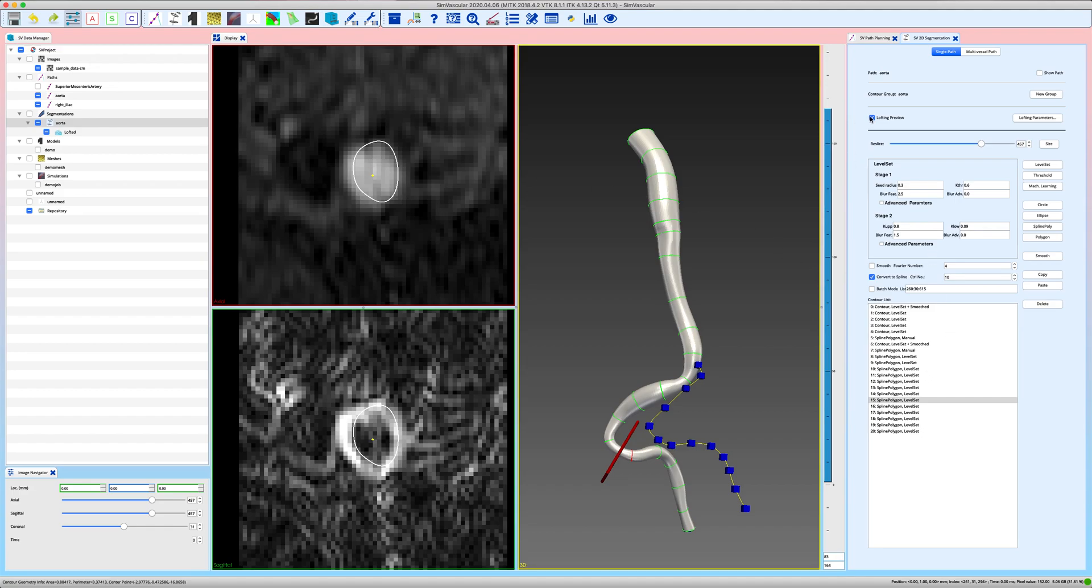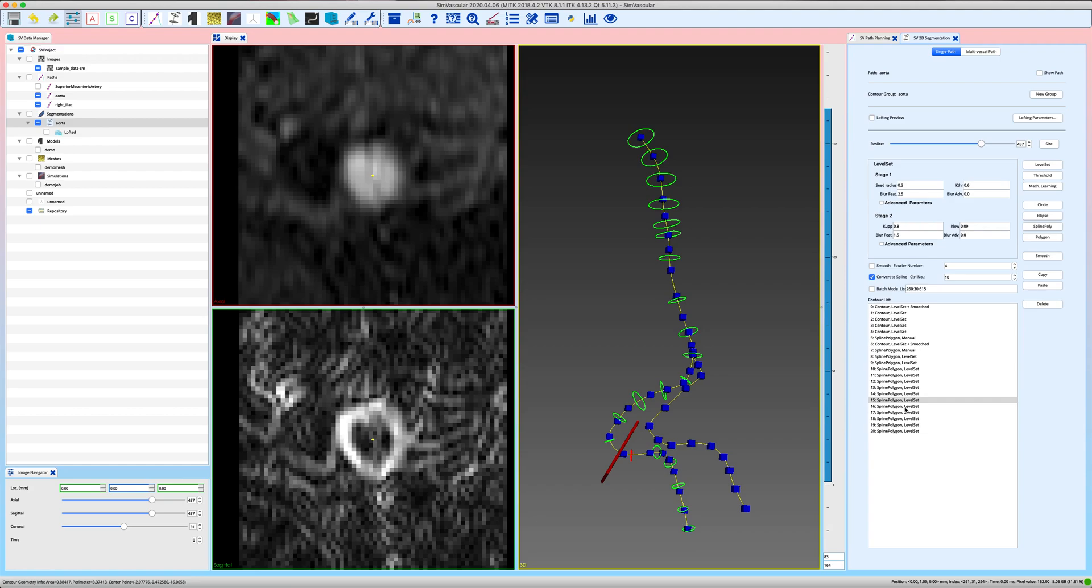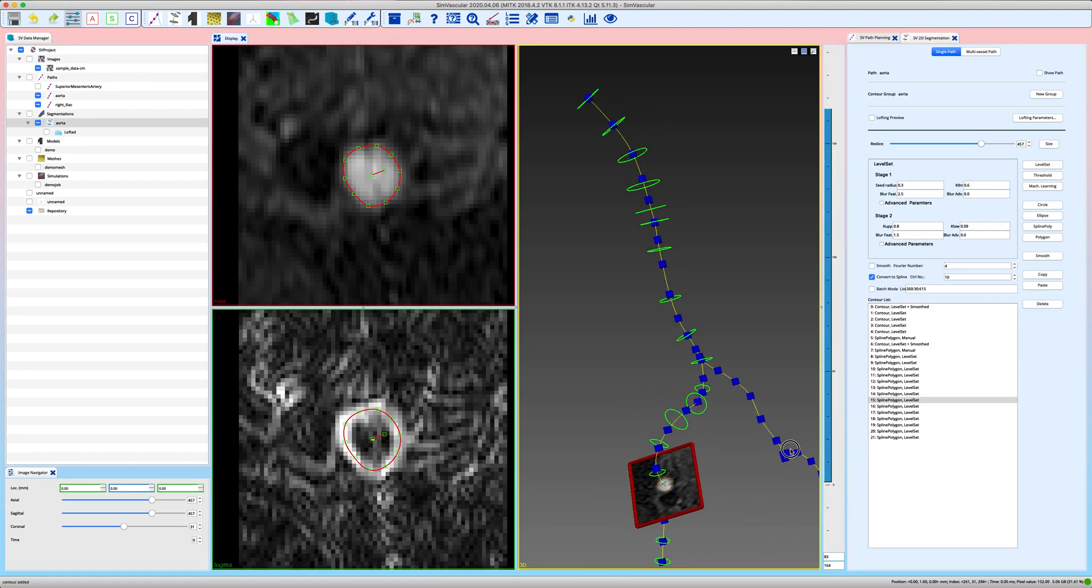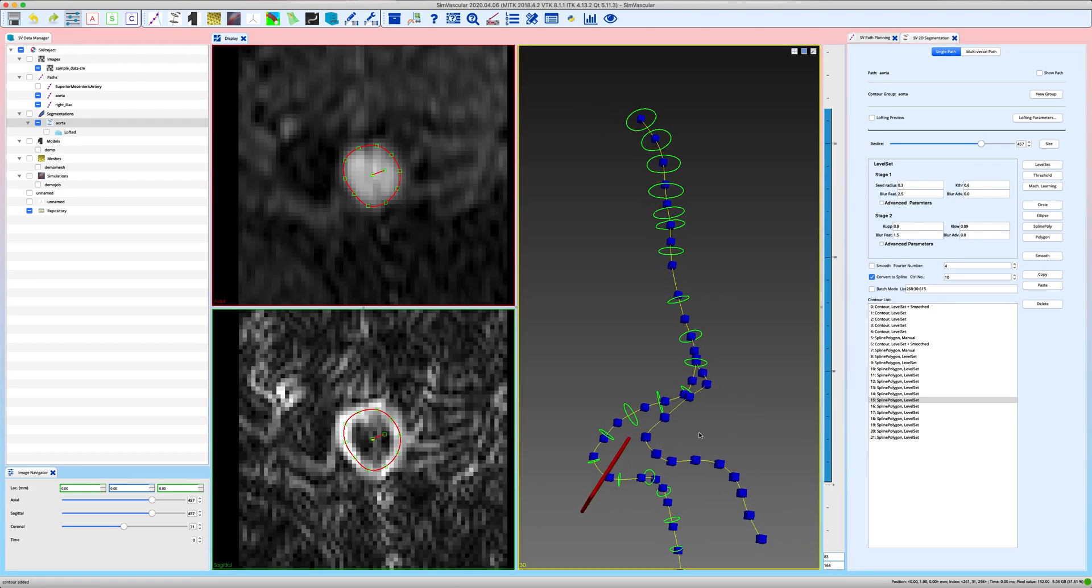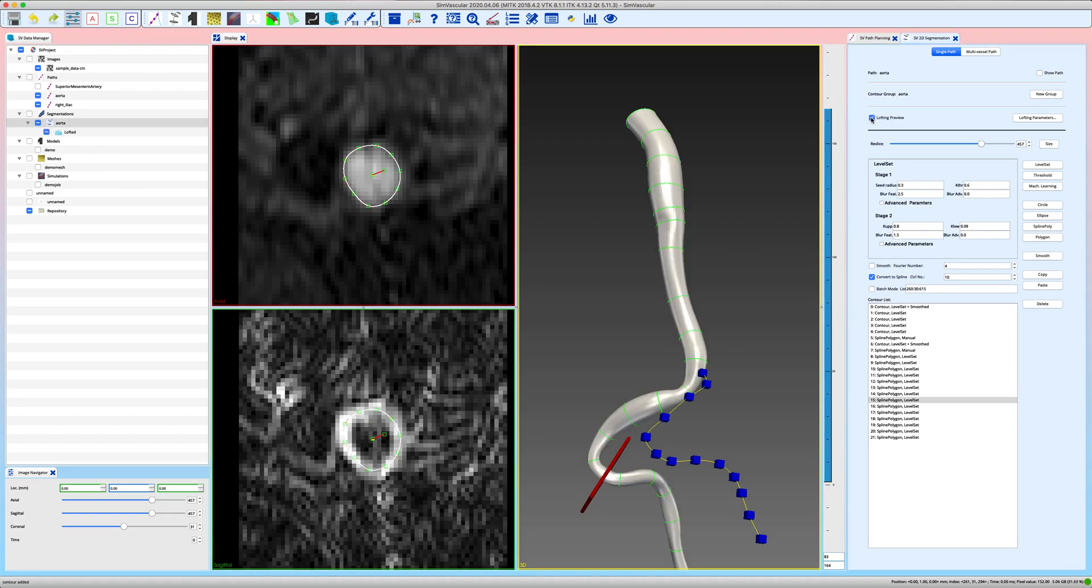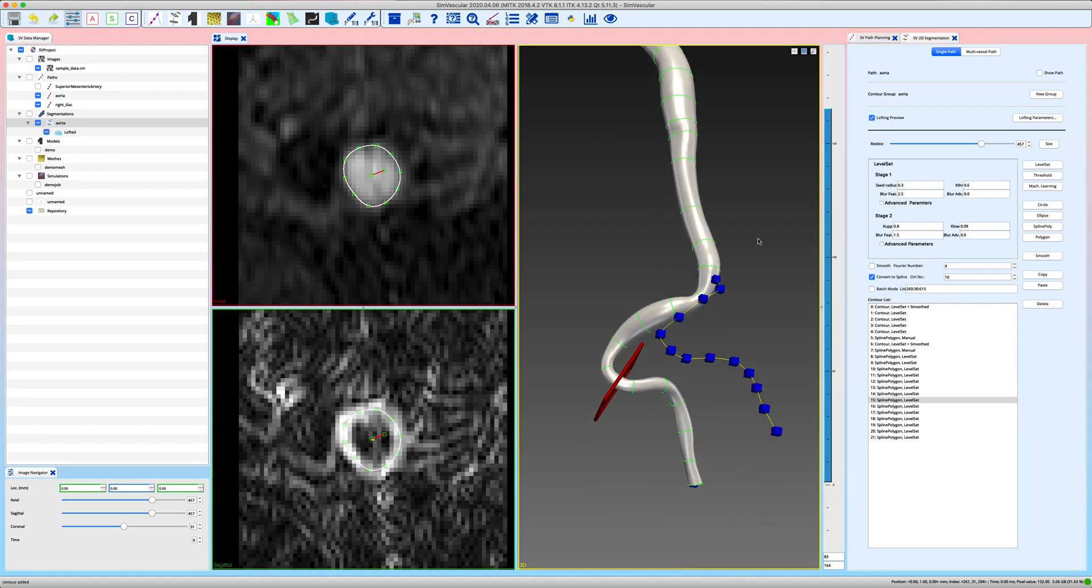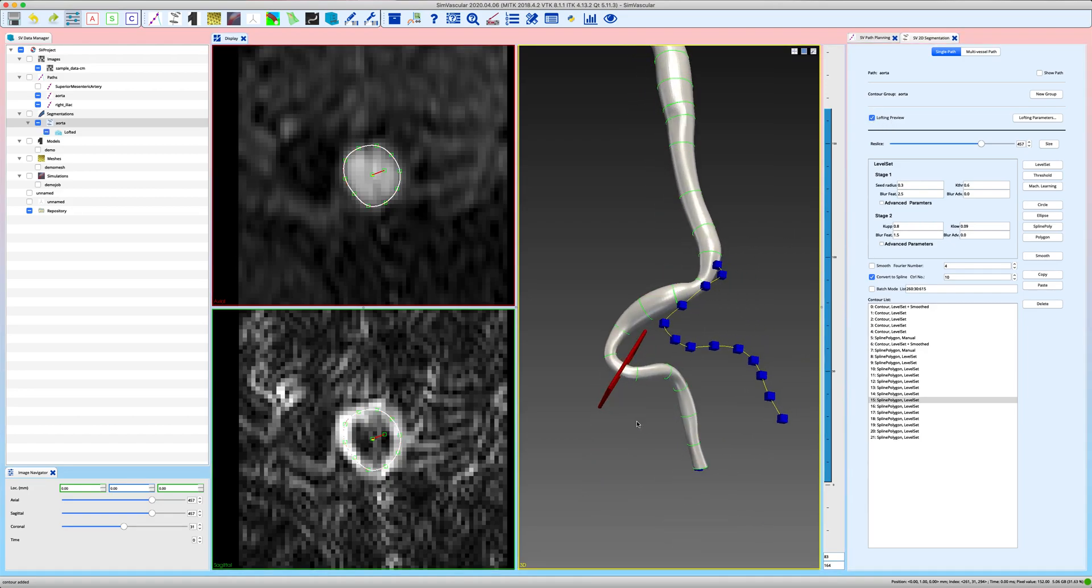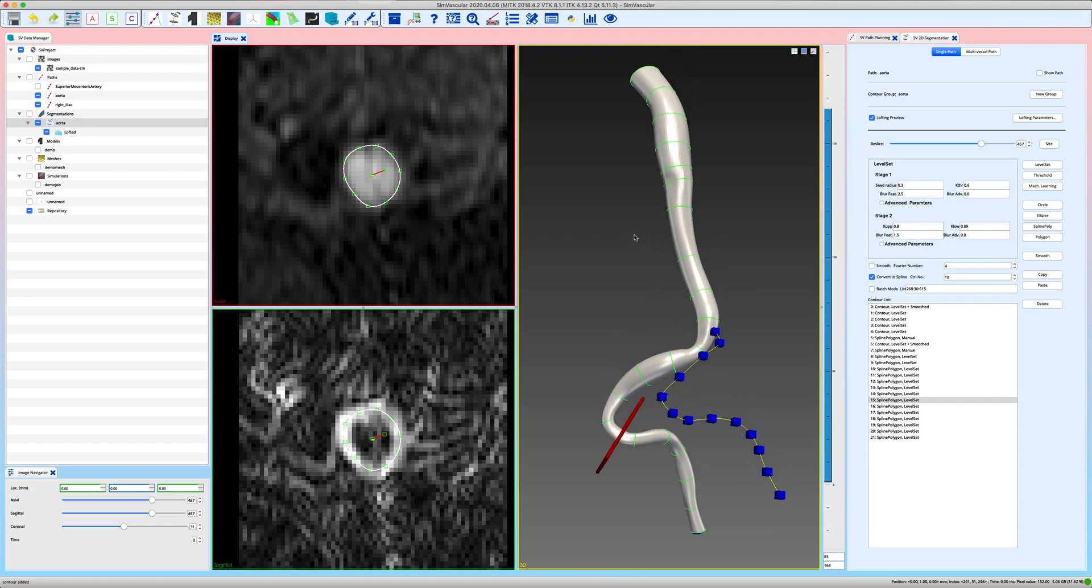So at this point I would introduce a new segmentation. That looks nice. Toggling on the preview again. Okay, and you would just continue like this until you are satisfied with the final lofting of your segmentations and they coincide well with the vessel that you want to model.